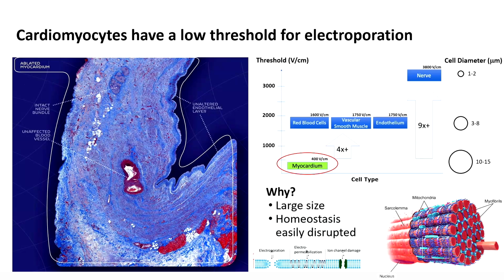So what I'm going to do for the rest of this talk, which again will be brief, is give you a window into what we think through as system designers for pulse field ablation systems. Sometimes I call my longer version of this talk threading the needle, because it's an extremely small design space that we have to hit to create a functional, safe pulse field ablation system for cardiac ablation.